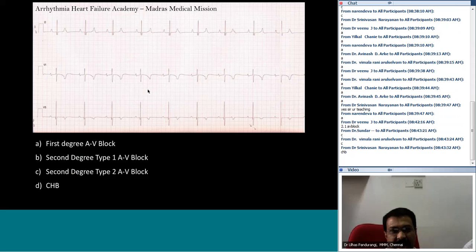I think one of those days, I have insisted that in a person, if you think it is a 2:1 AV block, most often it is CHB. That I'm sure you remember. In addition to that, I have told something else, which almost proves that indeed it is not 2:1 AV block, but it is CHB. It is extremely unlikely for a 2:1 AV block to be type 2 AV block. I want you people to remember this.